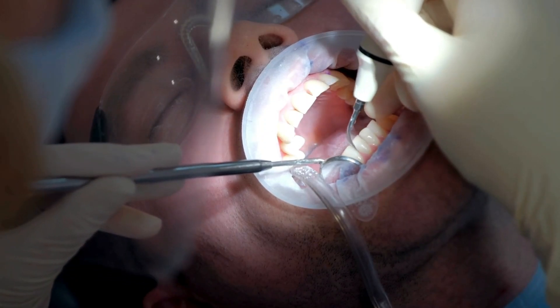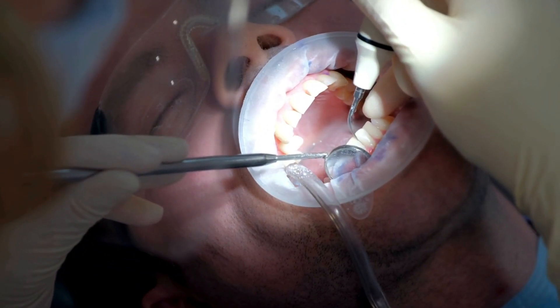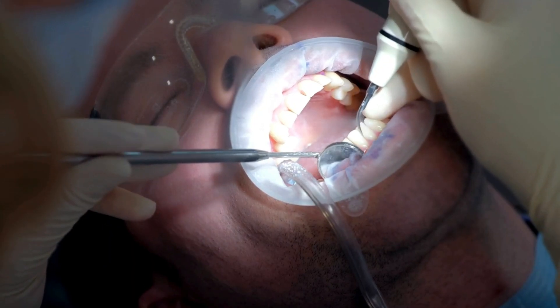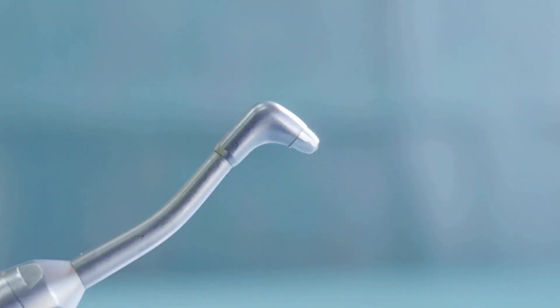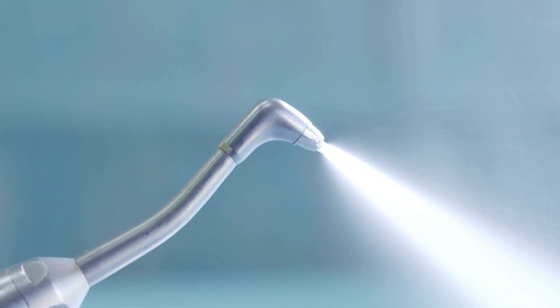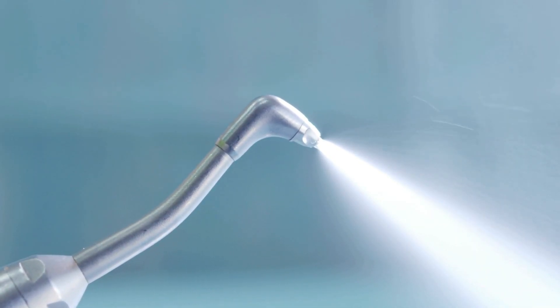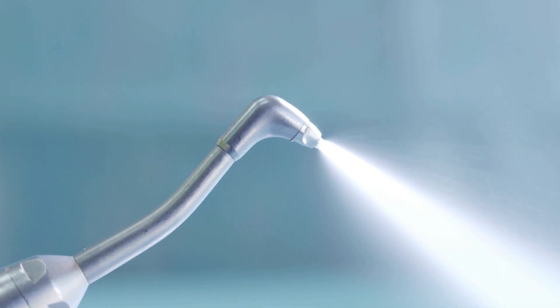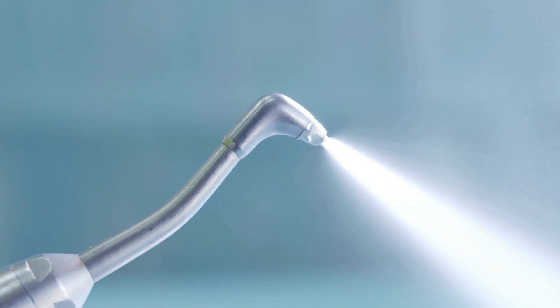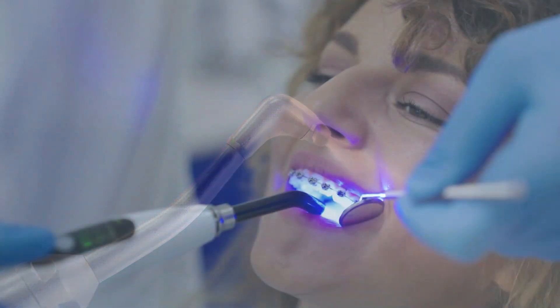Cavitron: a vibrating device used to clean teeth. It works like stone-crushing machines — it ensures that stones on the tooth surface are broken down and removed by disconnecting them from the tooth. Air water spray: a device that sprays water and air for the purpose of removing foreign substances on the tooth, washing, cooling, and drying the tooth.